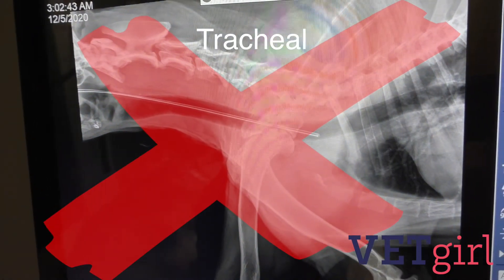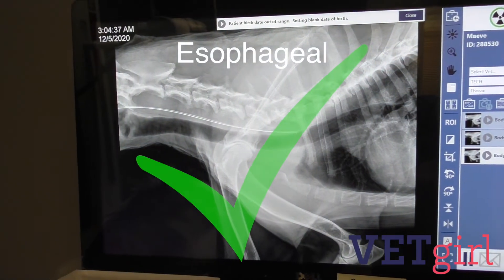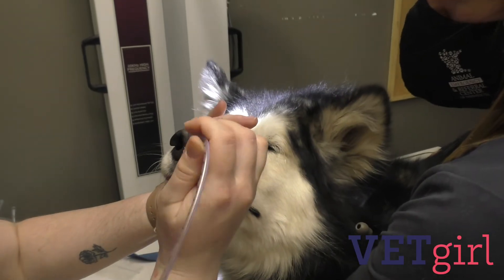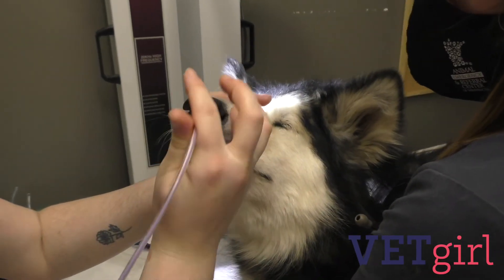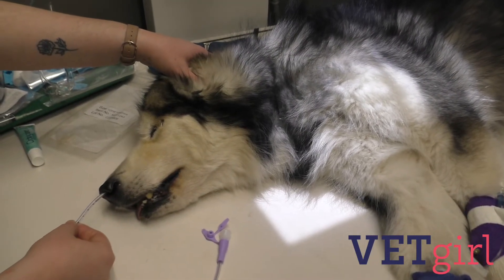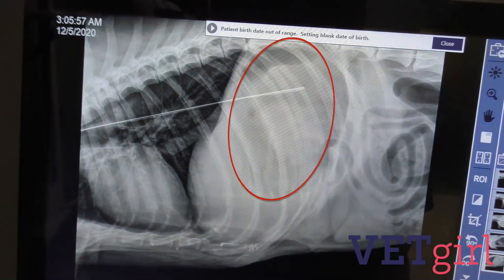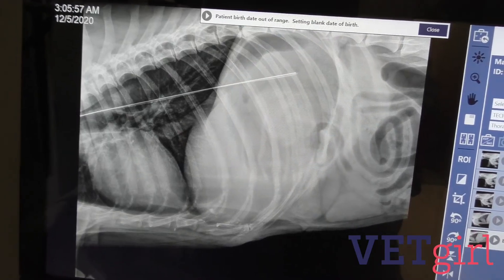Appropriate placement of the feeding tube should be confirmed by visualization of the tube bypassing the larynx and entering the esophagus on oral exam with a laryngoscope if the patient is adequately sedated, by the presence of negative pressure on aspiration or the presence of gastric fluid, and by confirmation on a lateral radiograph. Ideally, the tube should not be sitting against the wall of the stomach but rather sit in the lumen to help minimize the risk of occluding the fenestrations of the tube.